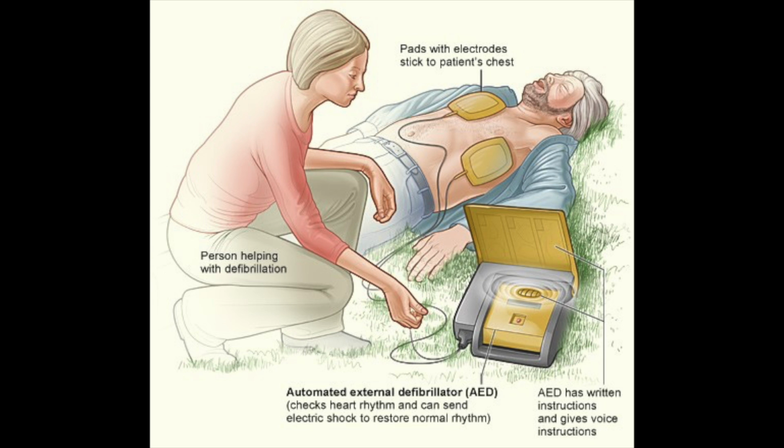Third, clear the victim and shock. It is critical that no one touches the victim or his clothing while the AED analyzes or delivers a shock. When prompted by the AED to deliver a shock, the AED user quickly looks up and down the entire victim to ensure no one is touching him and loudly states, "Everybody clear." The rescuer can now push the shock button.